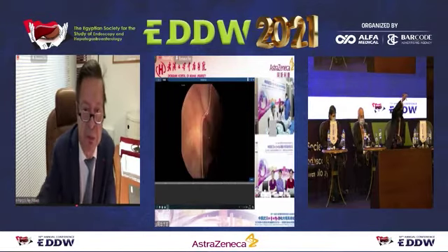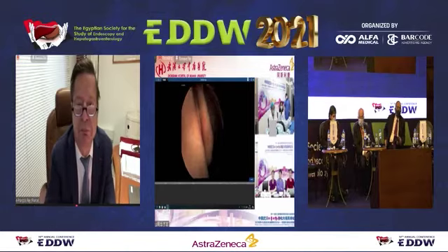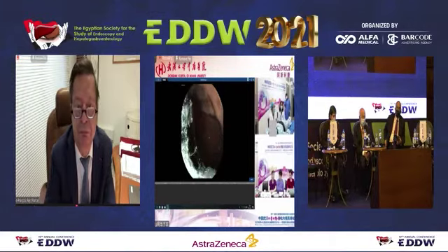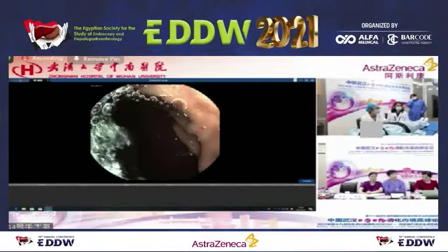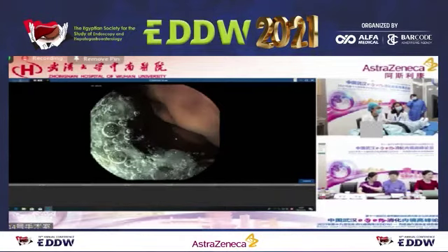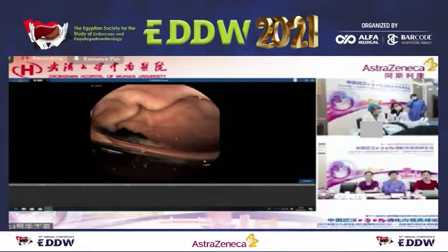Yeah. But to see the antrum and the pylorus, the best is to put the patient in the right lateral side. By moving the patient, you can see the antrum much better. Yes, the right side is a useful position to observe the antrum and the pylorus.